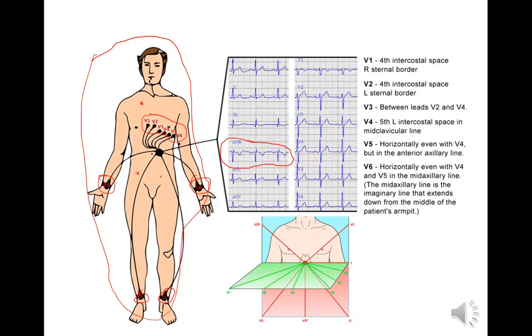Like if we were going to do stress tests, we do modified limb leads and put them on the chest and the abdomen because you'd be tripping over the wires, you're trying to take blood pressure and pulse ox at the same time. So the chest leads are pretty much left alone. I mean, the wires are a hindrance, but they kind of go under the shirt and you can keep them out of the way, which you can see.